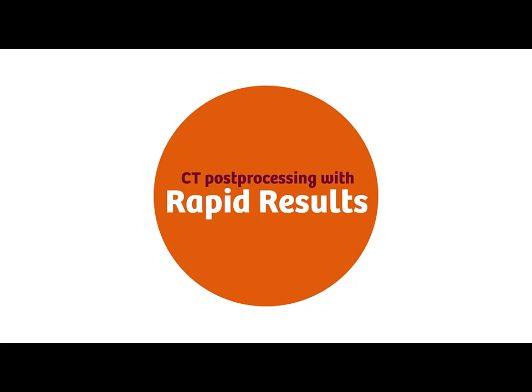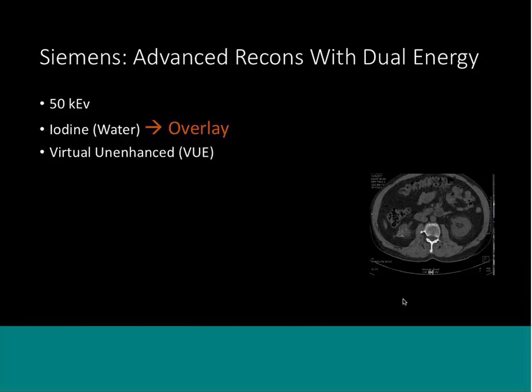What I want to focus on specifically here is going over what we're spitting out from the Siemens systems and the GE systems. And the workflow that we're going to focus on today is mainly the Siemens system, because we've successfully integrated the outpatient Forces as well as the outpatient Revolutions.